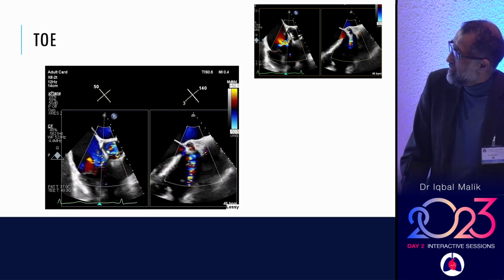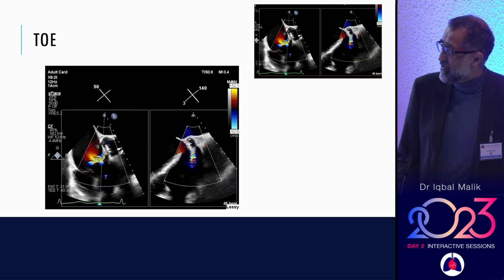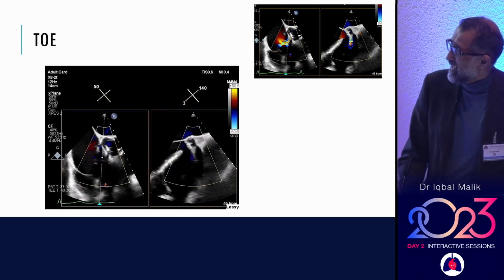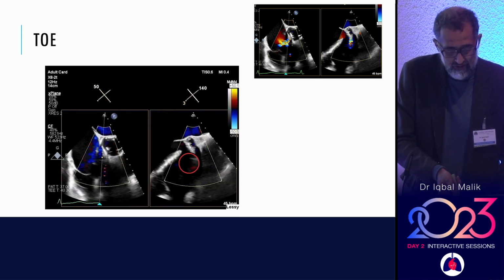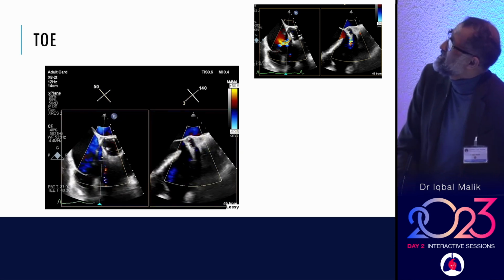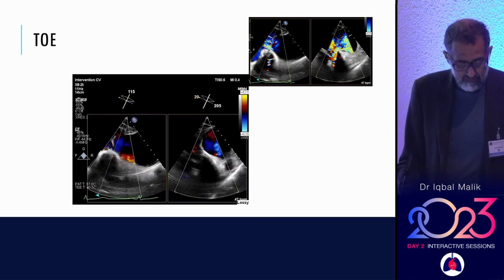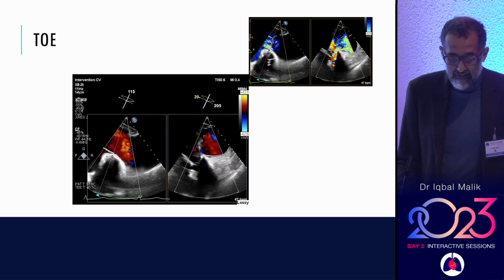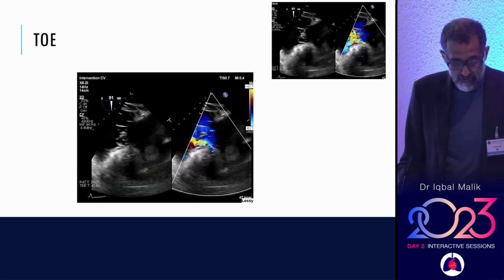Okay, so it's difficult to image because it's in such a funny position. You can just see a flame of color just proximal to the tricuspid valve. And on this other view here, you can see that there's a jet that comes out around about there, but imaging is challenging. So I put a still up there to show you exactly where it was. And here's another view where I think it becomes a bit more obvious with angulated pictures that there is a leak going on. Again, if you concentrate very carefully, you get the picture above, which shows the jet traipsing along the top of the tricuspid valve, probably.